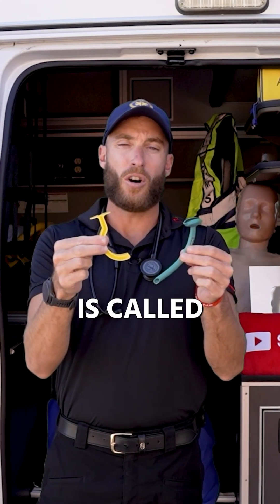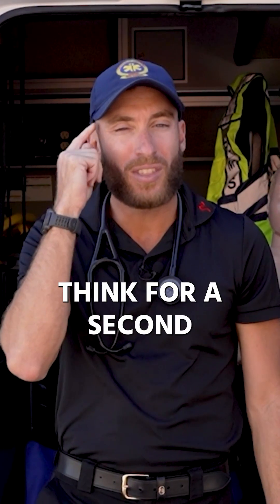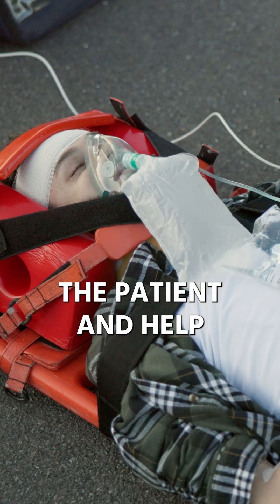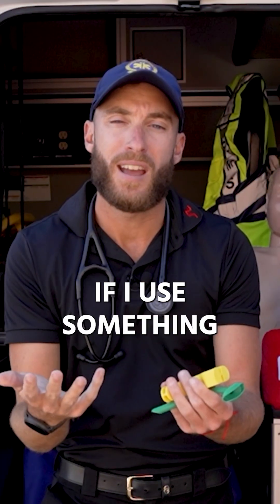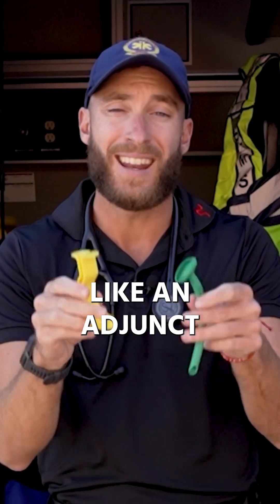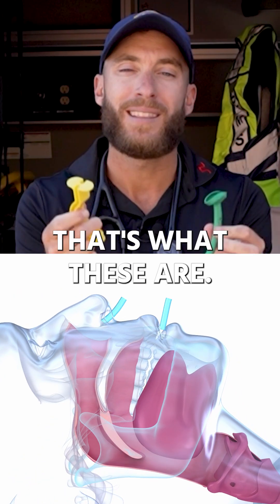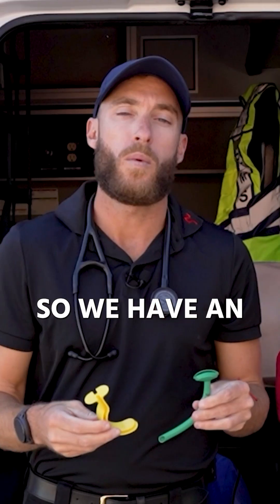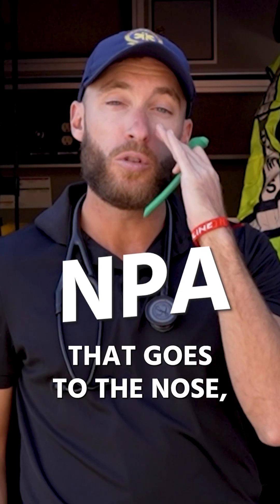What we have here is called an airway adjunct. I want you to think for a second — if I'm trying to ventilate the patient and help the patient breathe, wouldn't it be nice to use something like an adjunct to keep the airway open? That's what these are. We have an OPA, an oropharyngeal airway, and an NPA that goes to the nose.